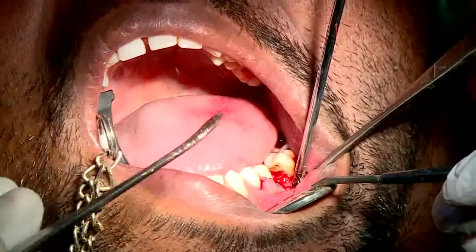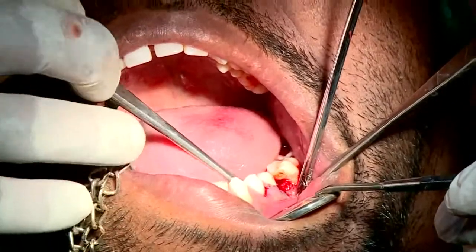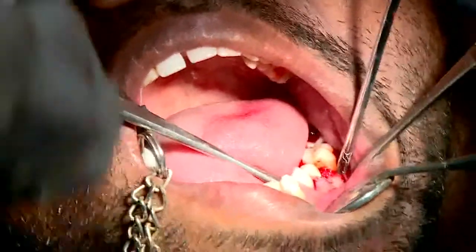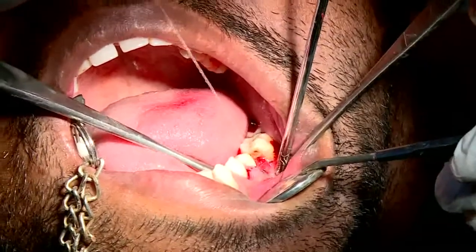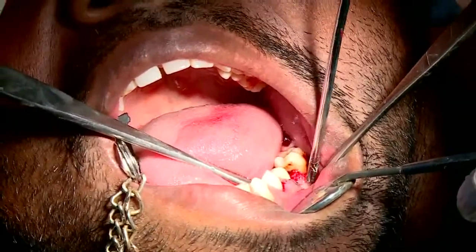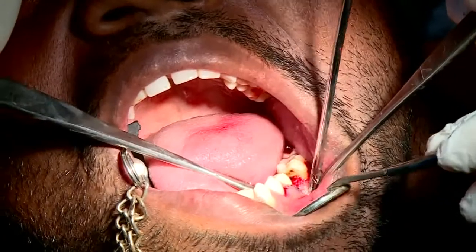You can actually see. I'll try to get the camera to show it. Can I have some sunlight, please? Yeah, there it is. Now my implant is proud by about 1.5 millimeter. I'll take one more mirror.